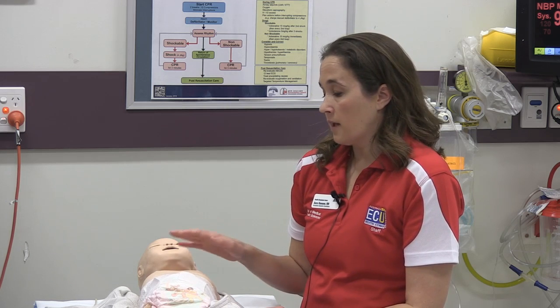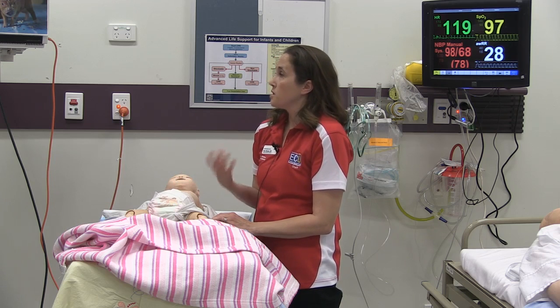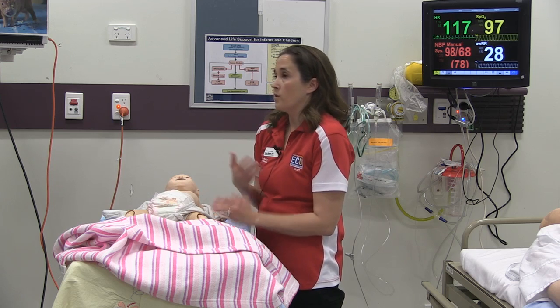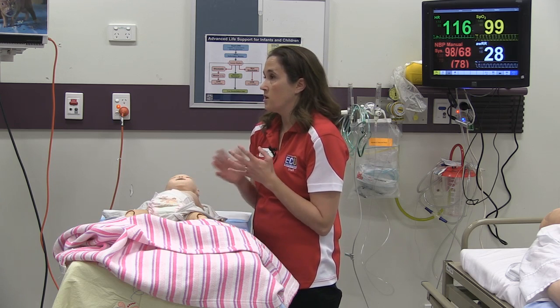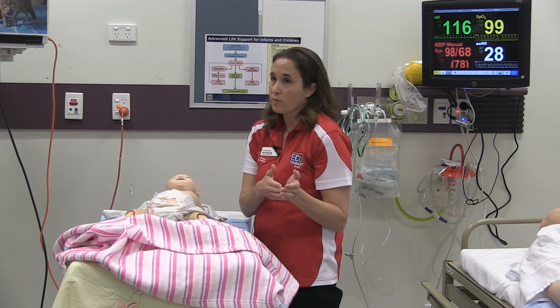When you bring in your students or your learners, you want to let them have a chance to put on a stethoscope and listen to the heart and lung sounds. Listen to what normal is. If it's built into your scenario that you have a difficult lung sound, you should let them listen to that as well so that they know that there's a change from normal.